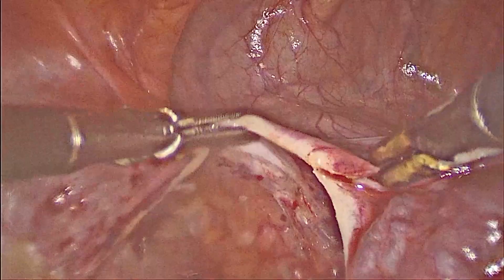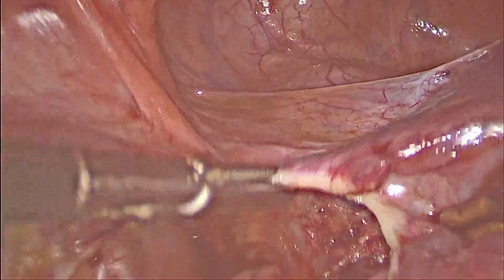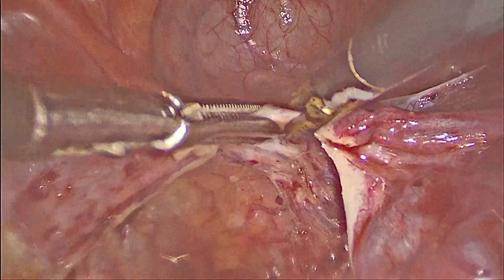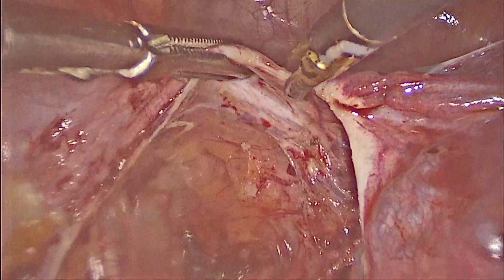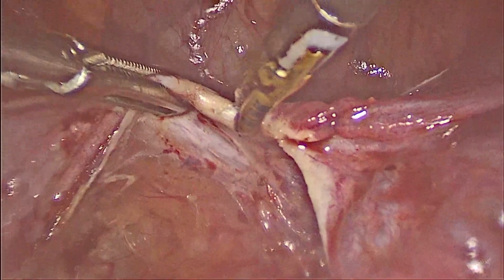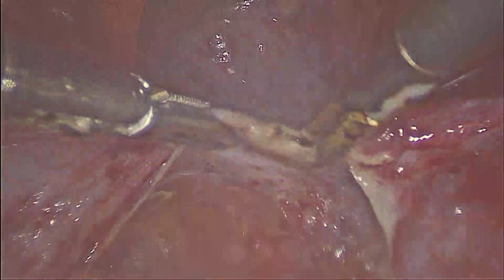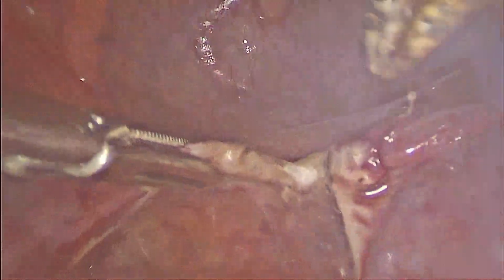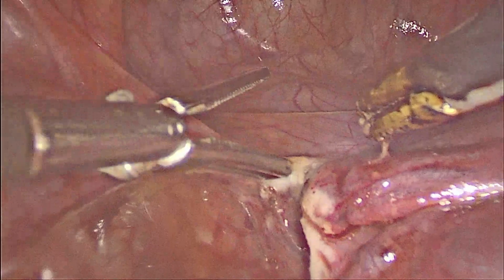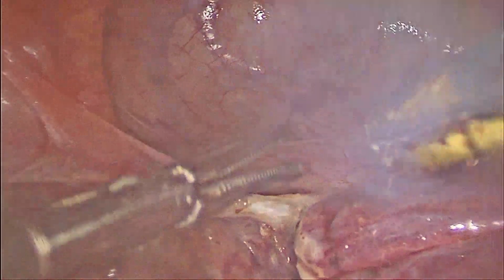Now we are dealing with the uterovesical fold of peritoneum. It is divided midway between the adhered area and the free fold to get a plane between the cervix and the bladder.